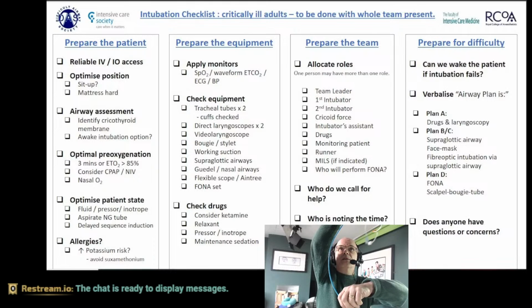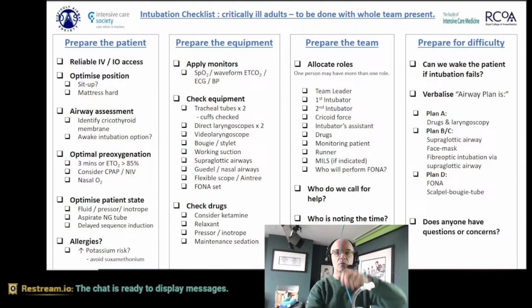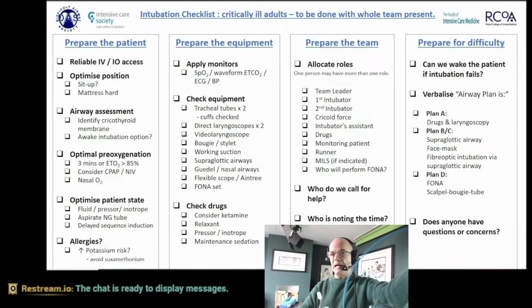So obviously that goes through the cords. Then somebody, whilst the person controlling the airway looks after the bougie, mounts this over the bougie. The person then passes it through the cords, and whoever's helping then takes the bougie out and away. And it's important that you communicate that if you're in that situation, that once you've mounted the tube, you say to the person doing the intubating, okay, I have the bougie, because you're going to grab the end of the bougie then to make sure that it doesn't move. The person tubing is going to grab the tube and put it through the cords. They'll say they're through, and you will say, is it okay to remove the bougie? Bougie out, tell them that, and then inflate the cuff for them. So that's also very important.